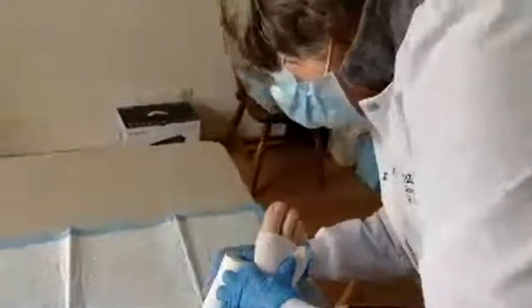And then when you come to the top of the foot, you want to fold this over, put a hand there, and take it and wrap it back over and under the foot, making certain that you try and keep it as wrinkle-free as possible. Now coming back to the front again, you want to fold this over and make certain that you keep it smooth, because if the patient has edema and you get double wrapped gauze, that adds extra pressure, especially with putting the ace wrap on, that adds extra pressure onto the skin. So we're going to zigzag back and forth.